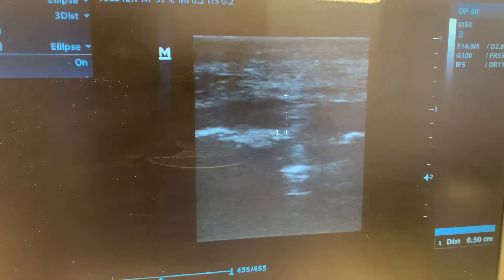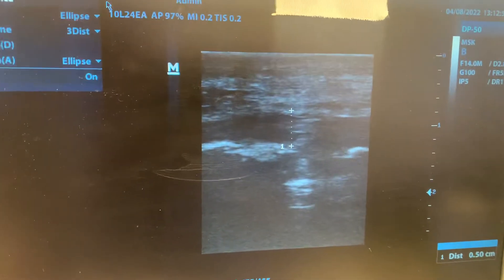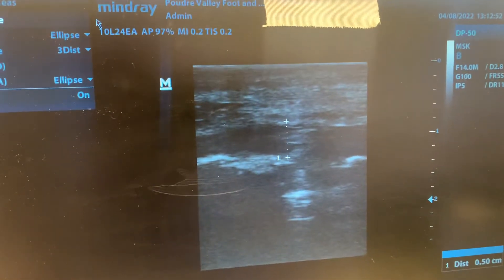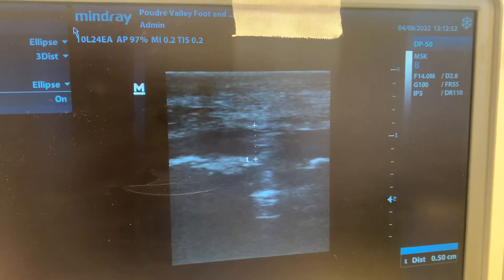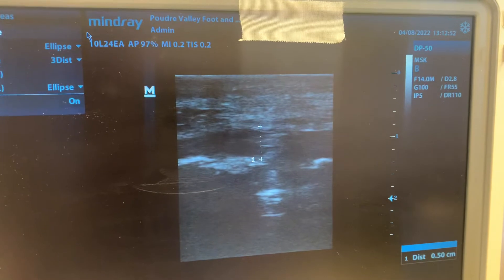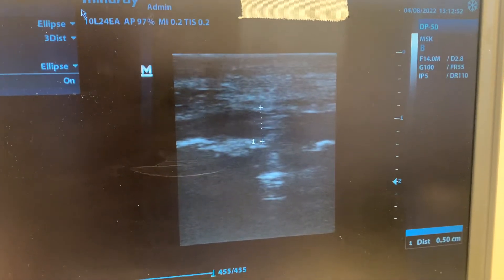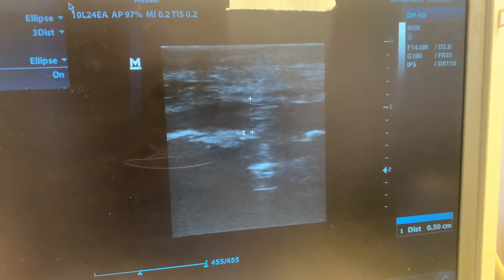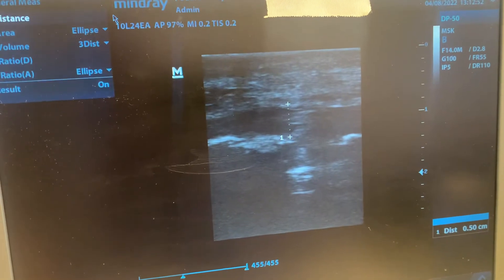His fascia is five millimeters of thickness. Kind of in the four to five millimeter range is what you would expect to be normal if you have no heel pain. The more severe the heel pain, the more severe the thickening is — and his was up to 8.9 before we did the procedure with the regenerative medicine.